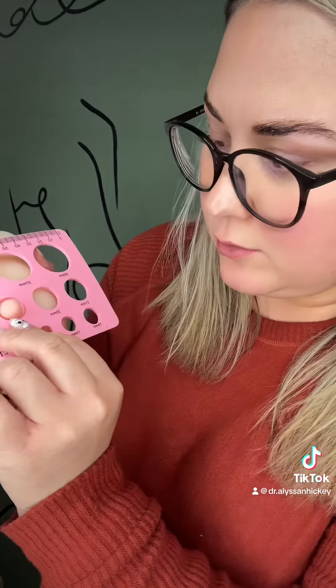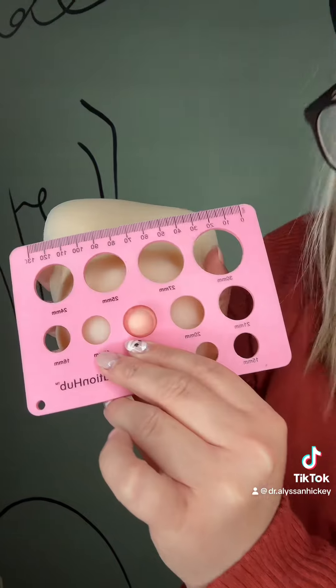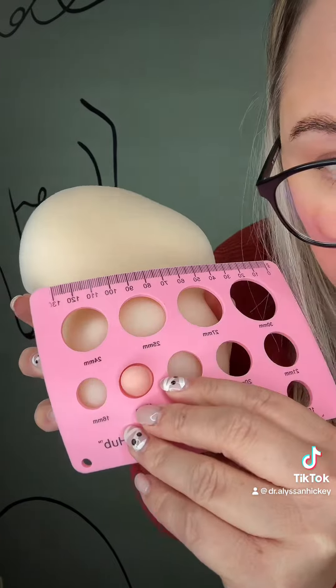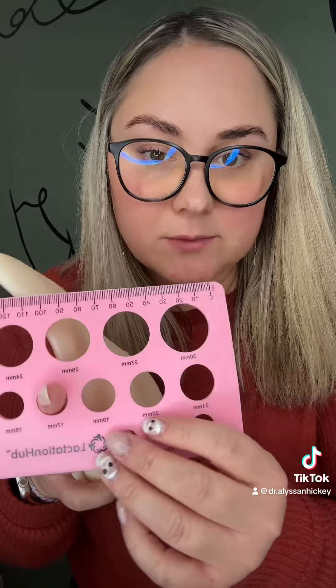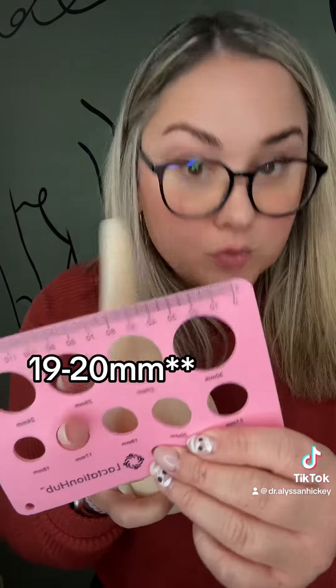So you want to go through and find a size that's going to fit a little bit better. The 17 is looking pretty good right there — there's not a lot of excess tissue around the outside. If you're measuring at a 17, you're going to size up two sizes, so this mom would probably be a 20 or 21.